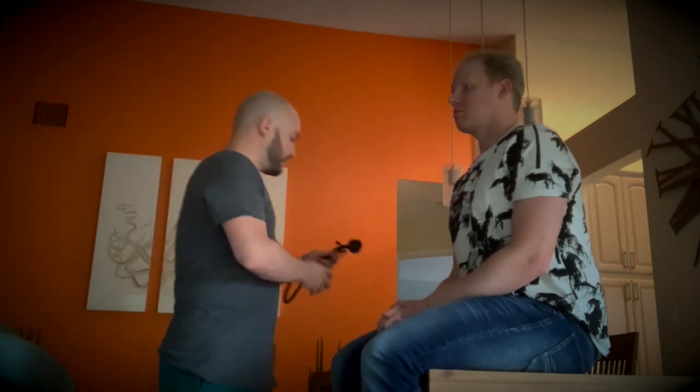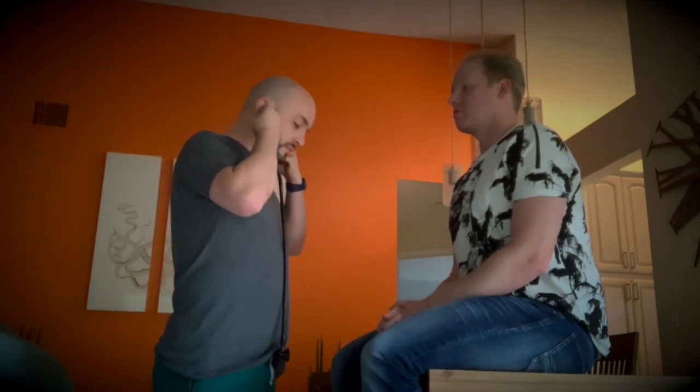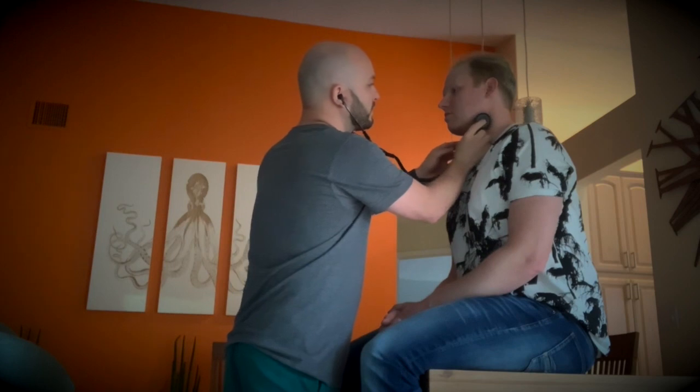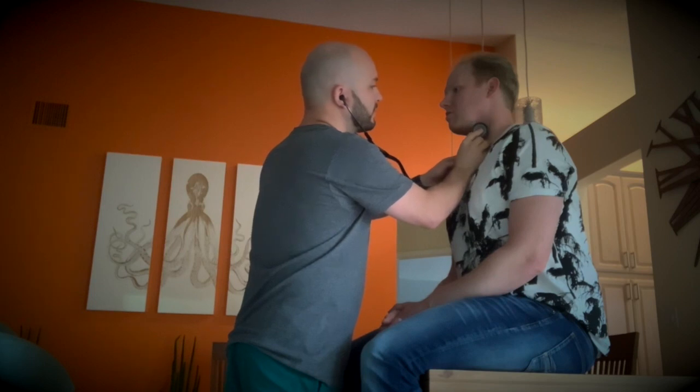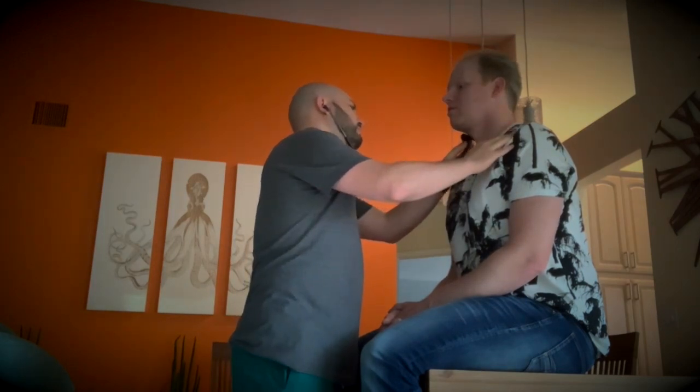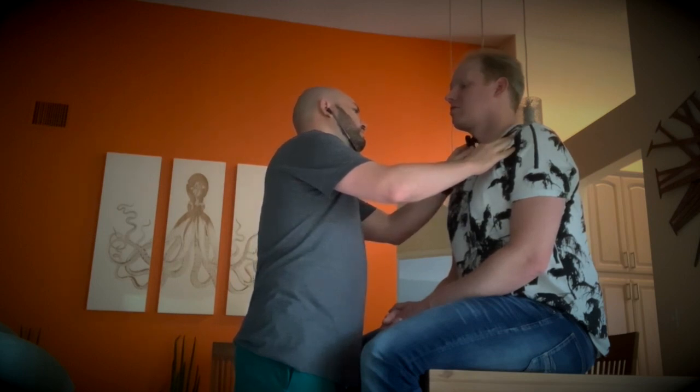Now we're going to assess for bruits. We're going to use the bell of the stethoscope since it's a low-pitched sound. No bruit heard, just normal.